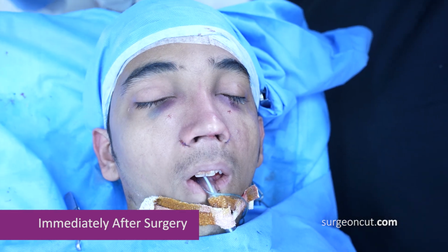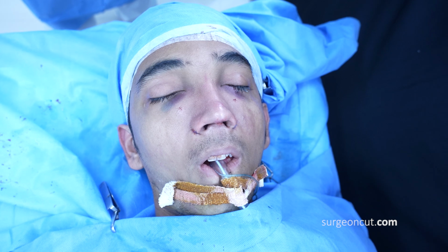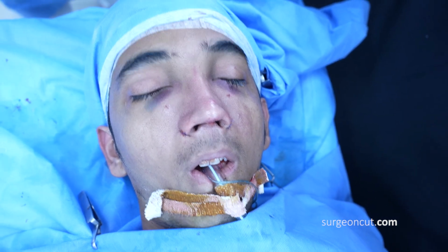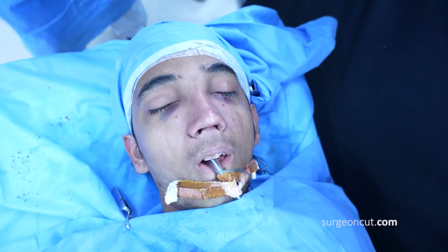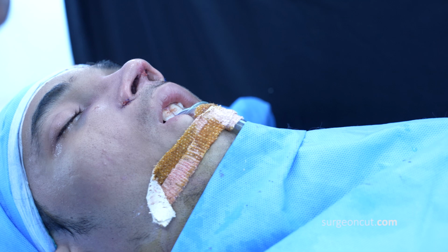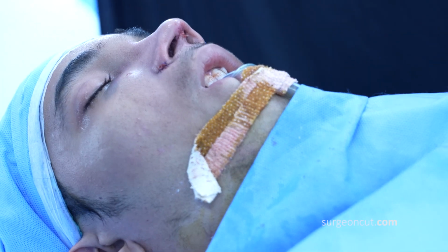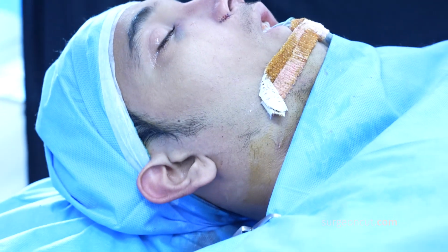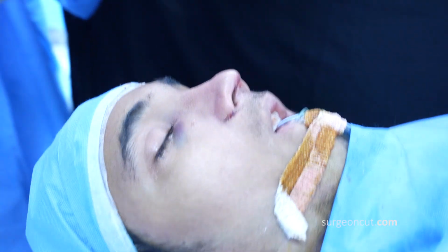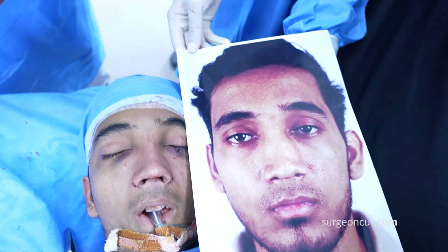Completed now with this rhinoplasty. So this was both a functional and a cosmetic nose job, also a revision nose job because it had already been done elsewhere a couple of years ago. So you can see the changes. We've made the nose slimmer, we've made it straighter. I'll show you some side view. You can again appreciate the tip, dorsum, radix, columella. See the improvement. I'll show the side view.